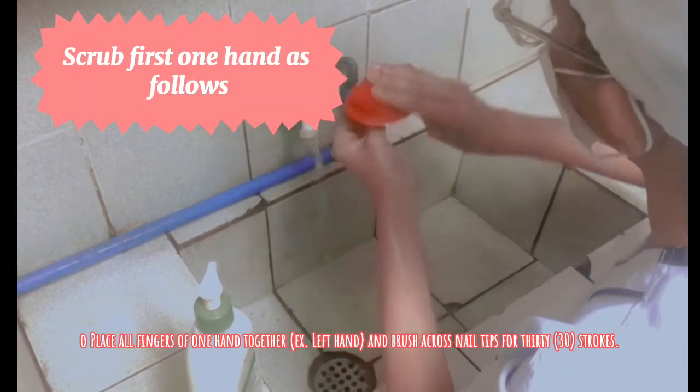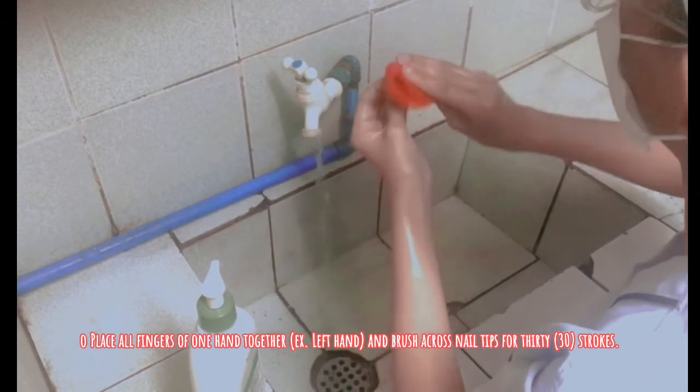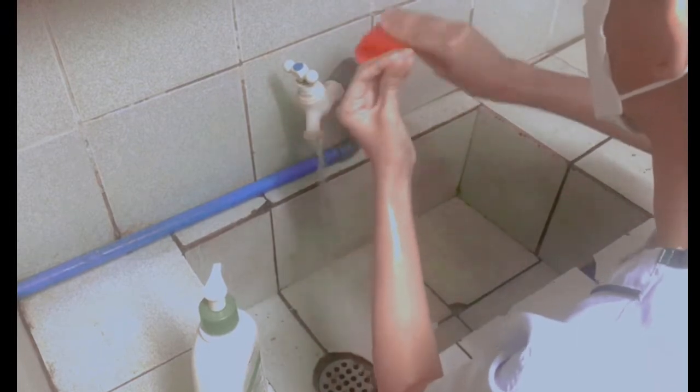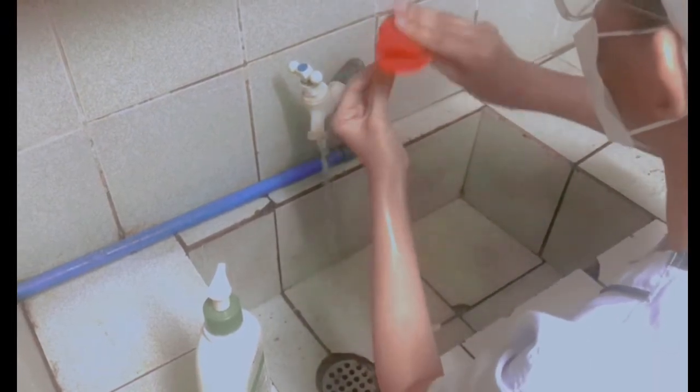Scrubbing individually and thoroughly allows all areas of the hands, even the fingers, to be washed properly. Using friction or circular motion removes the microorganisms mechanically.